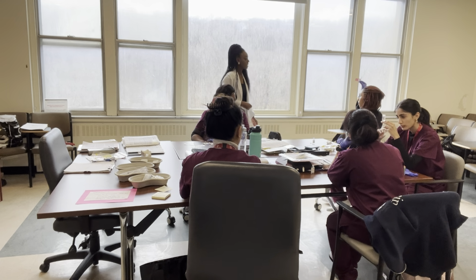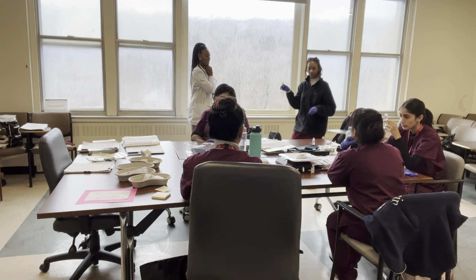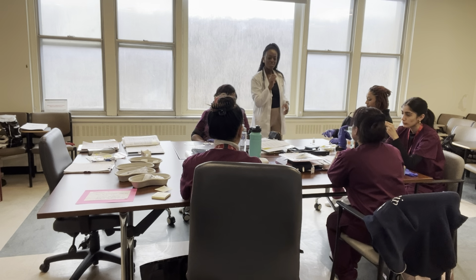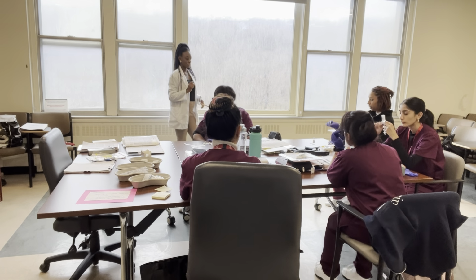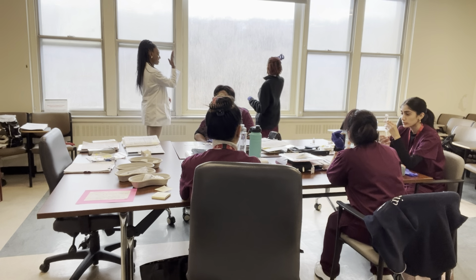Hold it in the air. So, I'll say do it again, but you never want to, because the way she was doing it is how she's gonna actually hurt her patient. You would never let go of the syringe when you're in. So, there we go. You inject it. Watch your needle, not me. Is it up? Is it straight? There we go.